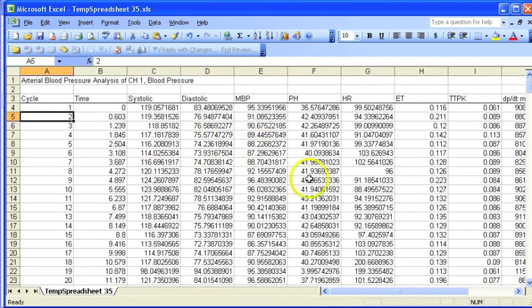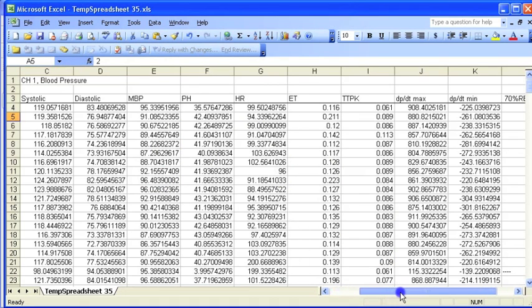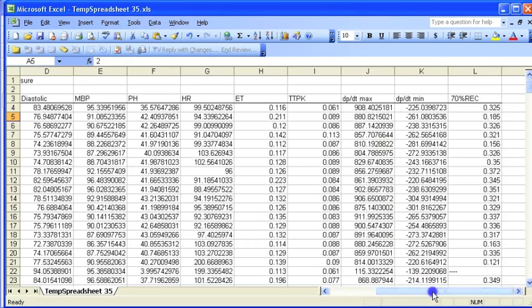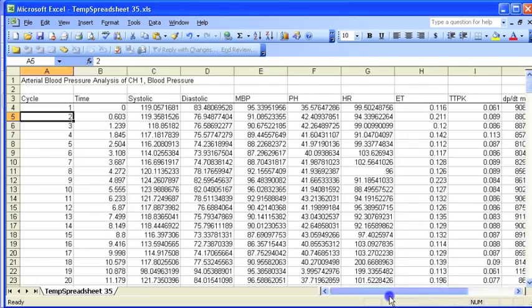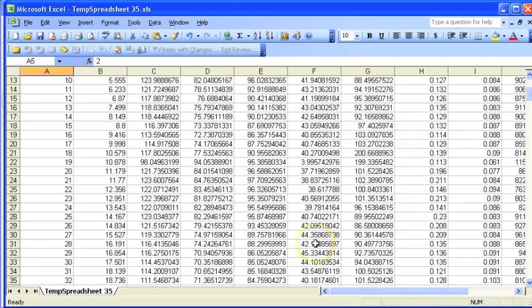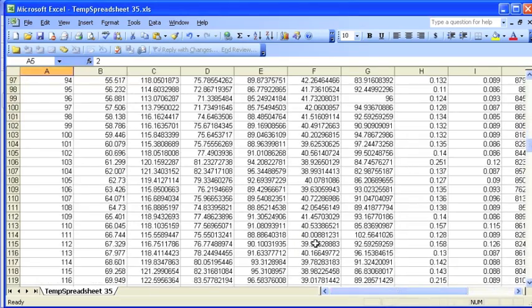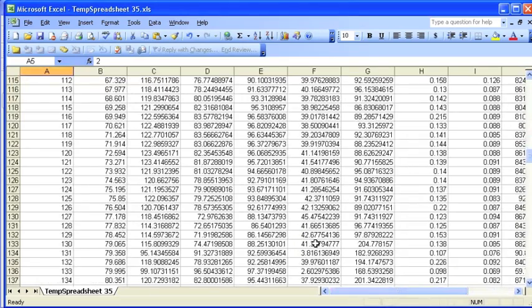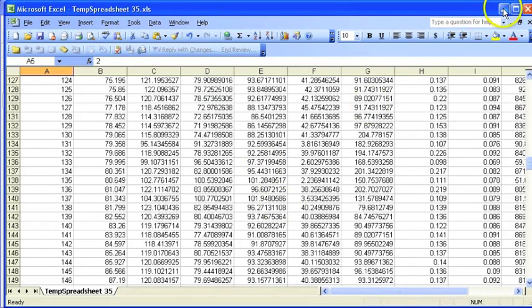The time, systolic, diastolic, mean, pulse height, heart rate, ejection time, time to peak, DPDT max, DPDT min, and then the percent recovery. And these values are all entered on a cycle-by-cycle basis, ready for further analysis.